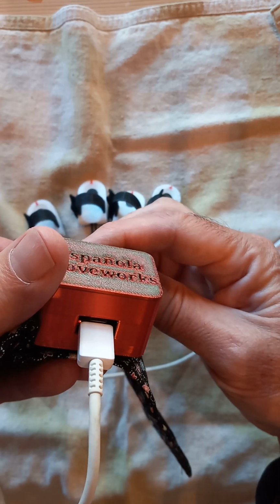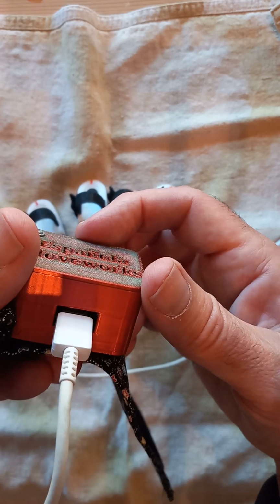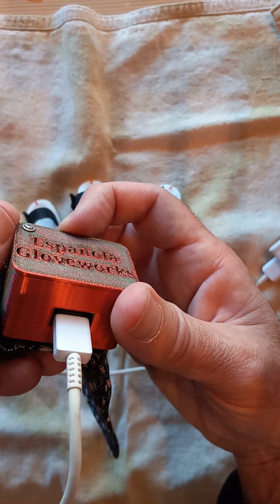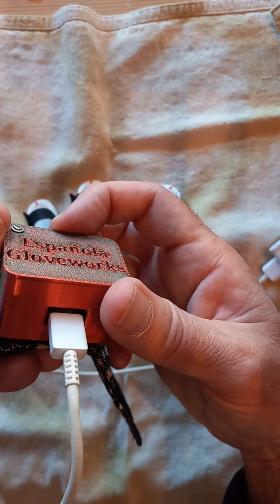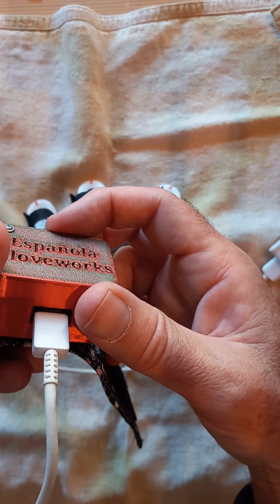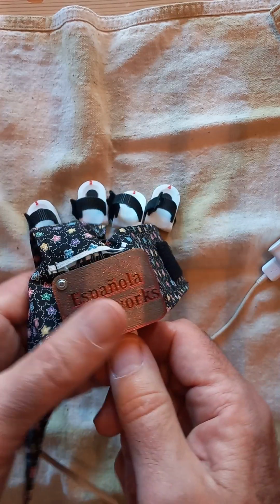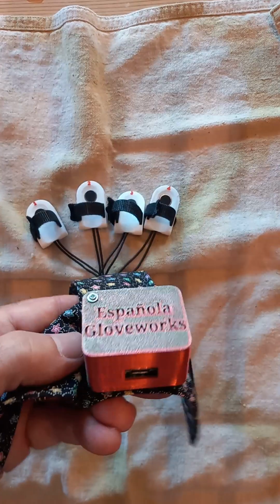And when I turn the glove on by flipping the switch, if the batteries are drained, we will see a bright red light, okay? If the batteries are charged, the small light goes off. So I recently charged this box, so we're not seeing that bright red light. That means that we plugged in the USB, but we're not really charging the battery. I turn the switch on, and with a bright red light, it means they're charging. With no light, it means they're fully charged. So then I can turn the gloves back off, unplug the charger, and they're ready for the next wear.